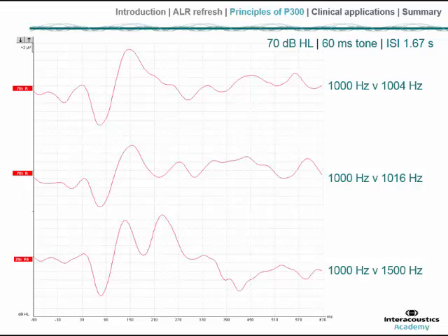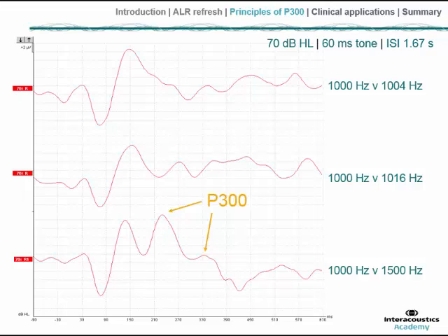We see just the traces for the oddball target presentations, not the standard or difference traces. In all three cases the non-target was a 1000 Hz pure tone. In the lower trace, the target was a 1500 Hz pure tone — 500 Hz higher in frequency — which should be an easy discrimination task for a normal hearing listener. We see a relatively high P3a, with the P3b around 330 ms. Evidence for the N2b response just prior is also visible.